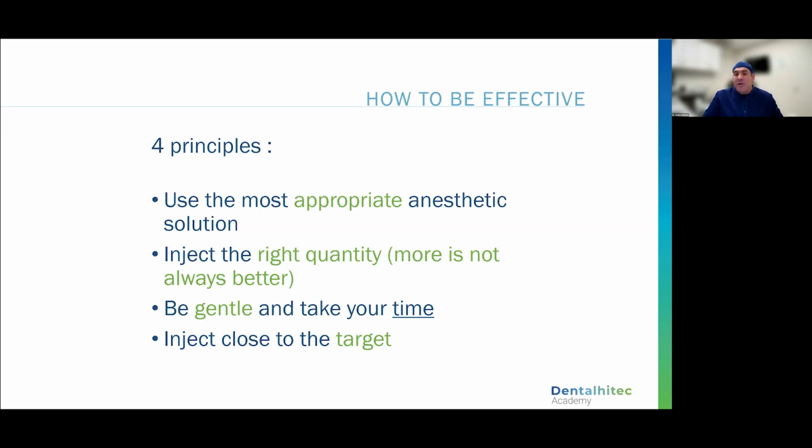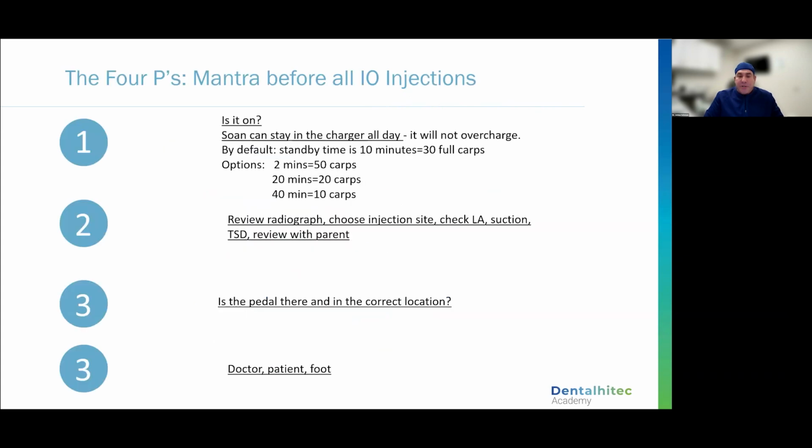It just may feel longer to you. Until I started using these devices, what I really did not appreciate was I've been giving local anesthesia too fast. I really have. And that's where patients are feeling pain and pressure.